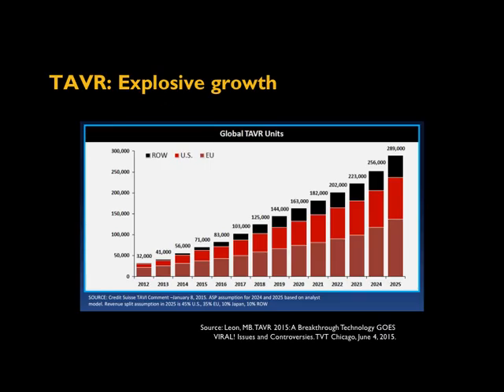So TAVR came onto the scene quite a while ago now. This chart we see here from the literature actually goes back to 2012. And you can see that over the years, TAVR has been growing and growing and growing. And this growth is expected to continue for quite a while. So we as radiologists should anticipate that we're going to start seeing a lot of TAVR if you're not doing it already. And the number of cases we see is just going to increase over time.